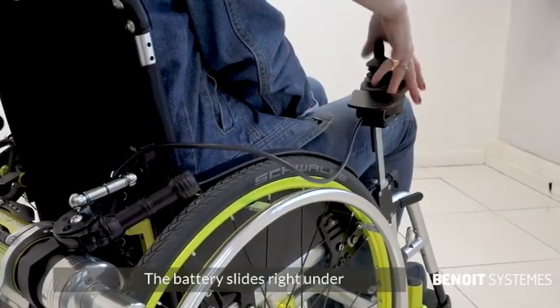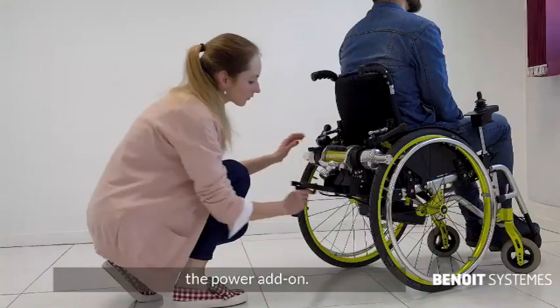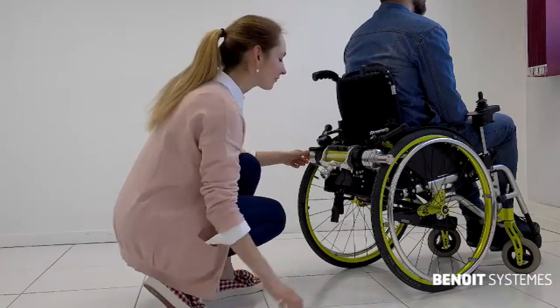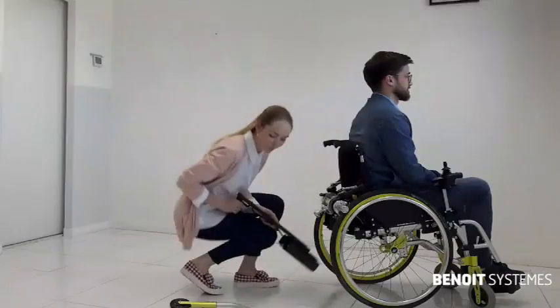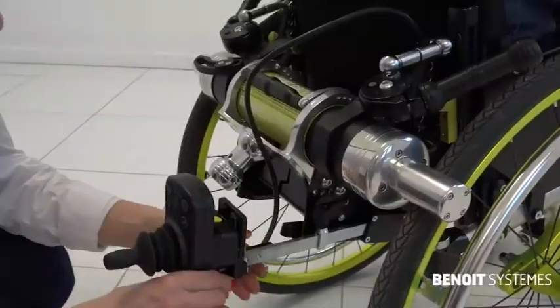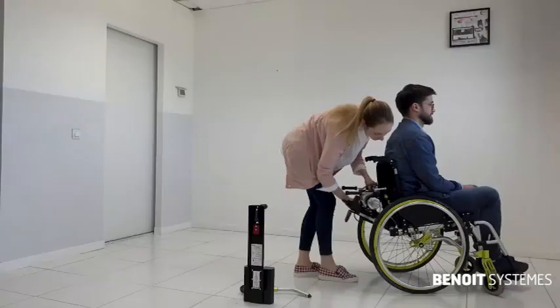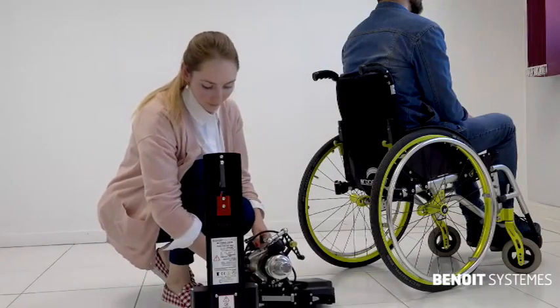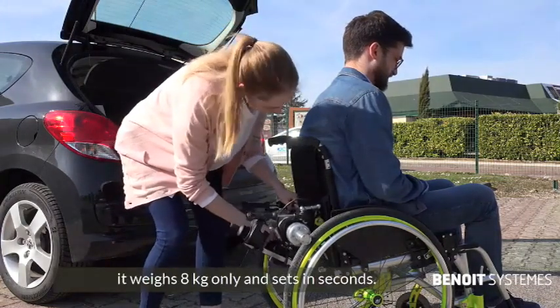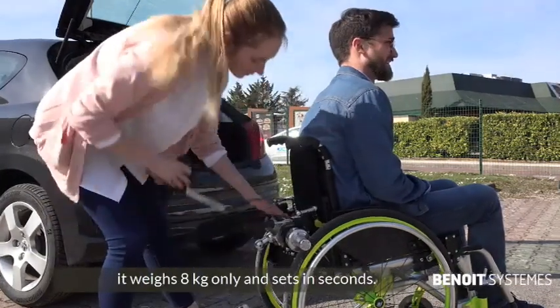The battery slides right under the power add-on. An anti-tip is added to ensure the safety of the user. The power add-on can easily be transported in the car. It weighs 8 kilos only and sets in in seconds.